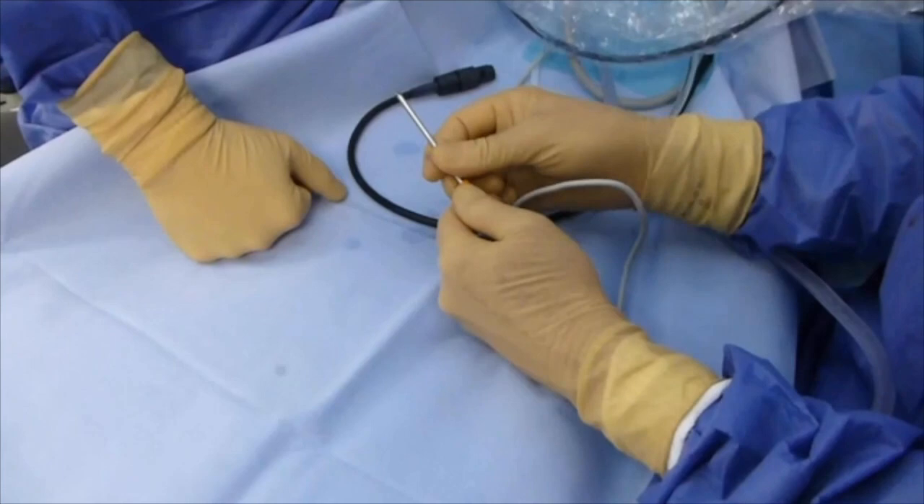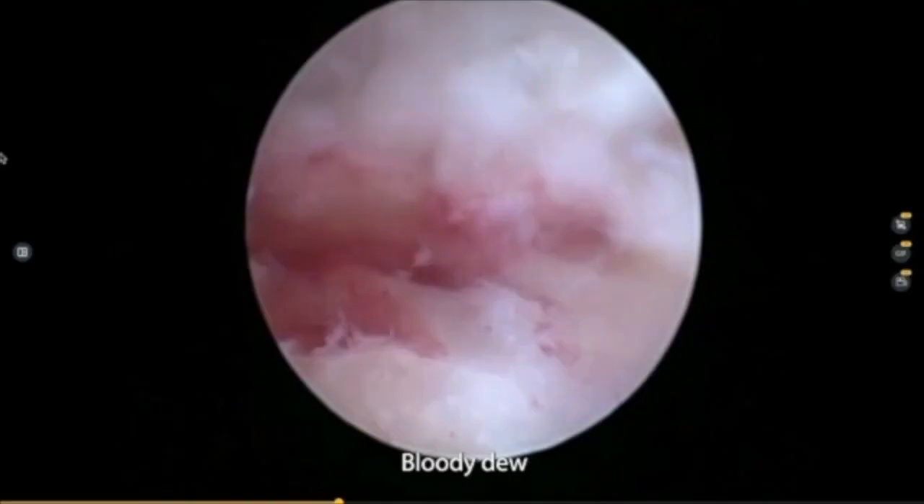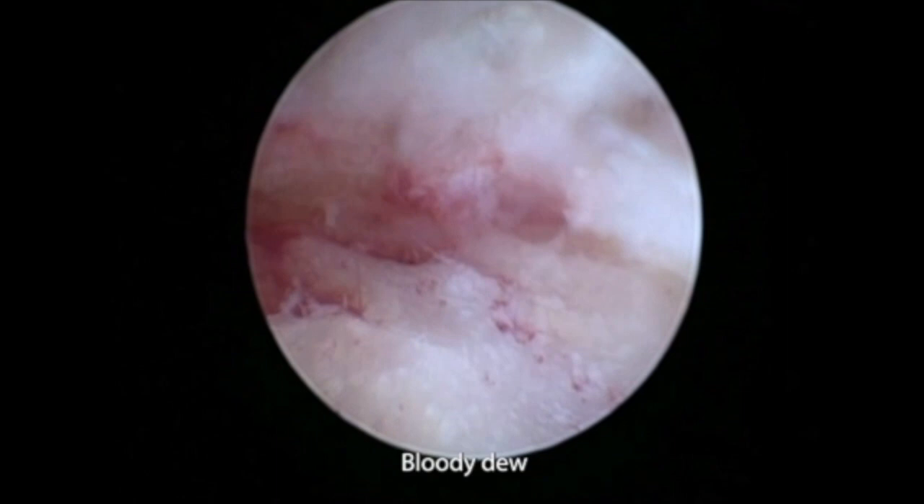The debris from the burr can be removed with the use of the burr alone. However, the procedure produces a lot of intra-articular debris, and aspiration with the motorized blade can be obstructed by the multitude of debris. Abundant joint cleaning is necessary, and aspiration with a large-diameter cannula helps to remove this debris.